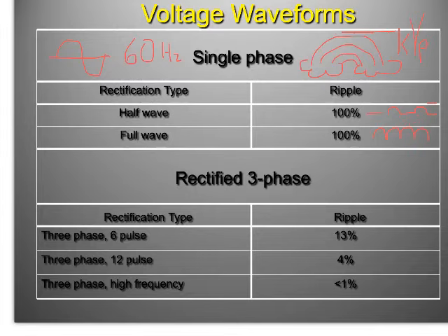We can see an illustration of what that type of waveform might look like on page 813. Yeah, 140 and 141. That's correct. Those demonstrate the high voltage, and so what we're seeing now is something more like this. This is as close to direct current as we can possibly get, in other words.